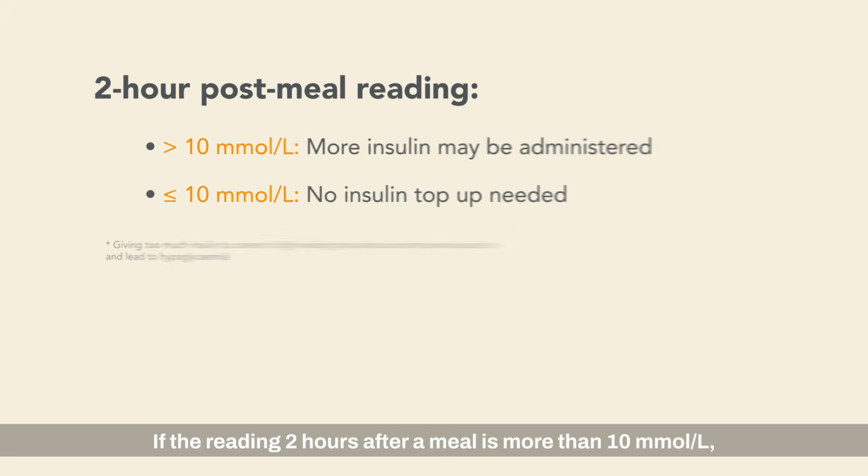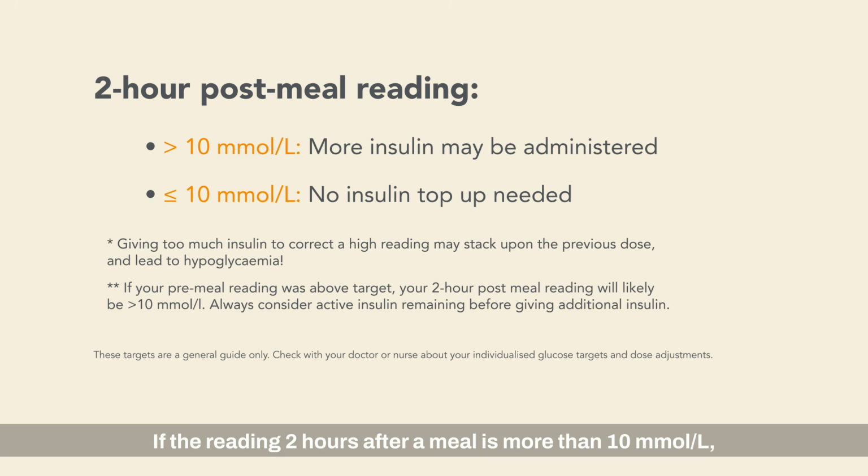If the reading 2 hours after a meal is more than 10 millimoles per liter, you may want to administer more insulin. Use a bolus calculator to account for active insulin given just 2 hours ago.